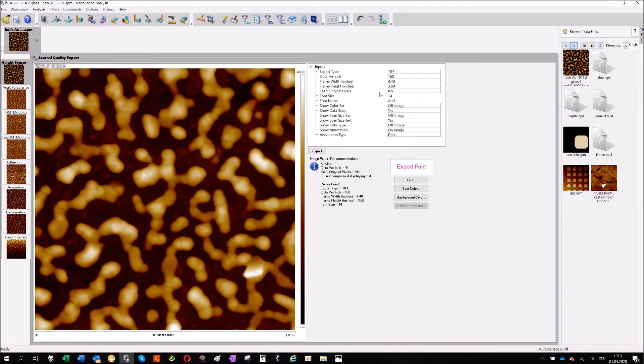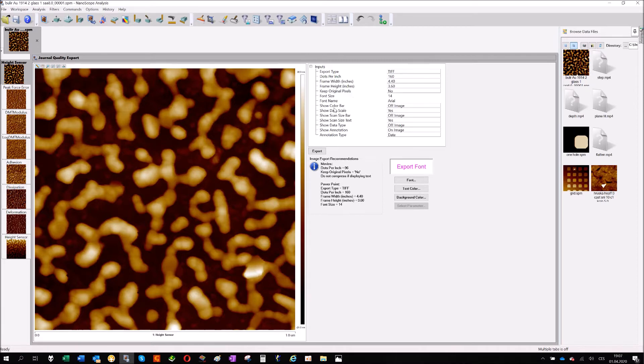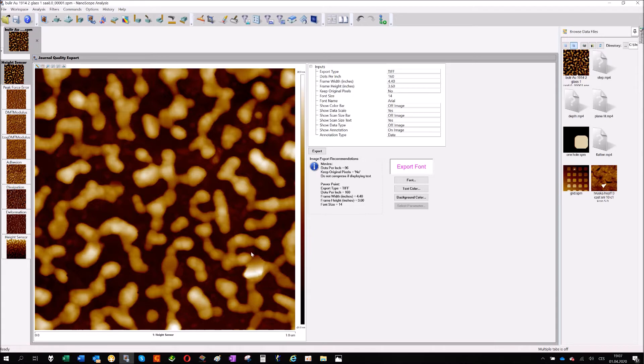What kind of marks or information do you want to have? Do you want to have the color bar which represents the Z height? Yes or no. Do you want to have the scan size information? Yes or no.